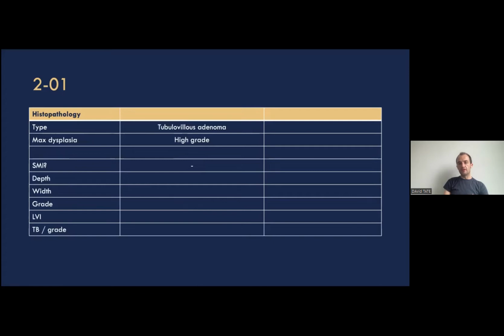So indeed, as you said, it is actually a tubular-villous adenoma, because if you want to get technical, the pit pattern there is 4, or the vascular pattern is Kudo type 4, not 3. So tubular-villous adenoma with high-grade dysplasia. We didn't have the SMSA score in that slide, actually. Maybe you can just calculate it. I think it's maybe interesting that we calculate it now on a web calculator. So while you do that, Vikash, I will share the next one.